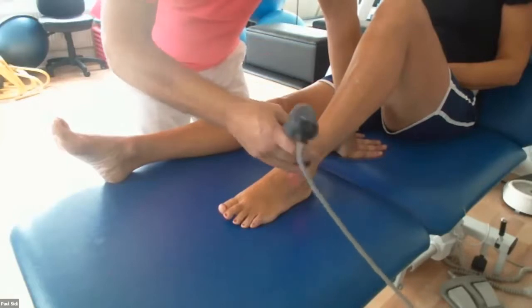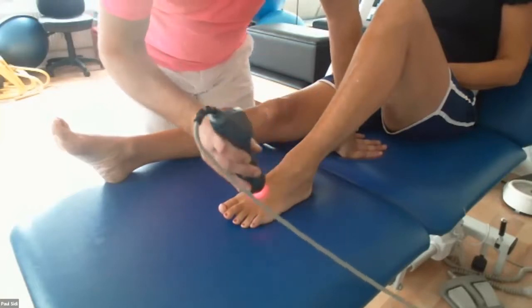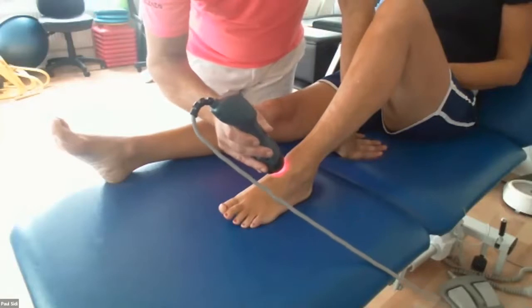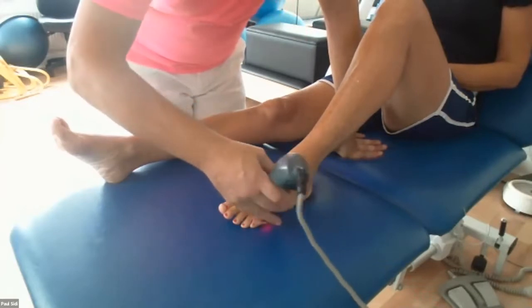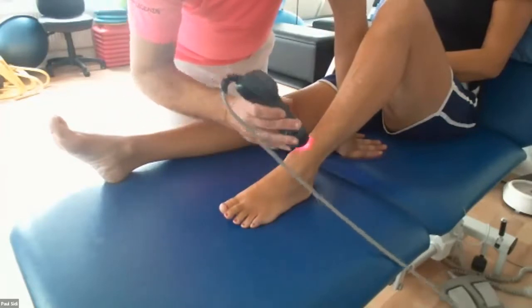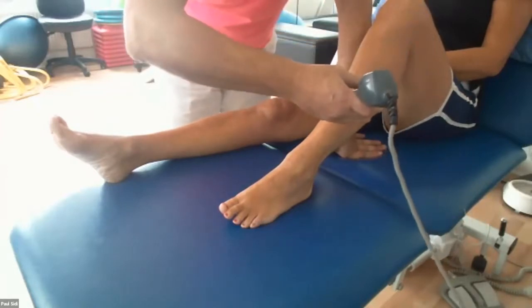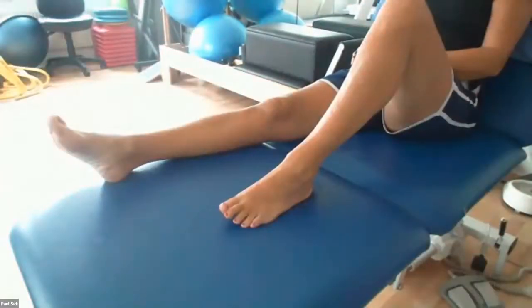Get on there. Let's come right over here, and then we can actually go right over the foot, just scanning all around this area. I can't remember how many minutes it said, but I'm not going to go on the full time. But we're doing all this over the foot. I'm going a little bit quicker than I probably should, because we're saying this is a fairly chronic situation, and in the chronic, we tend to scan a little bit slower. So right up here, and it'll keep on going until it's finished. Then it'll just stop, and you probably heard the noise it makes.